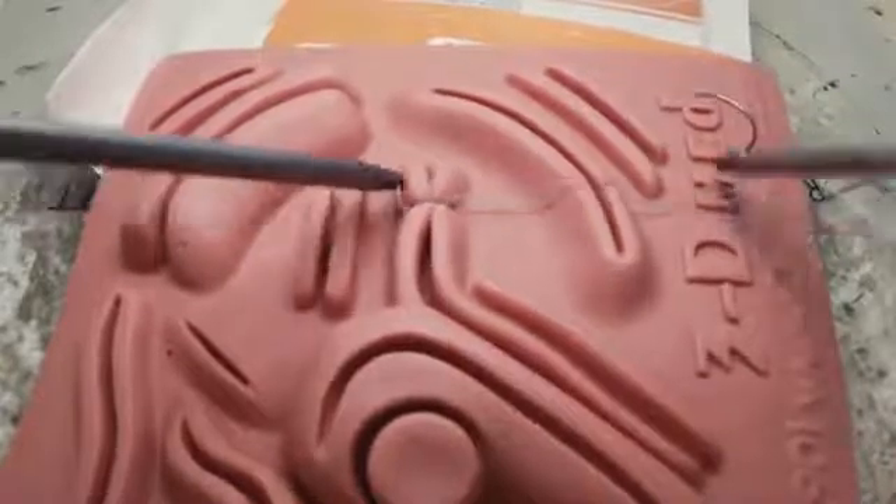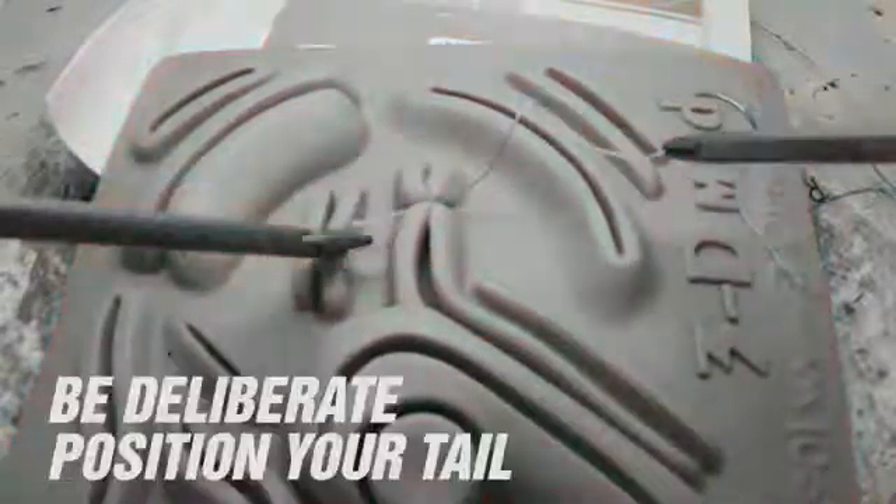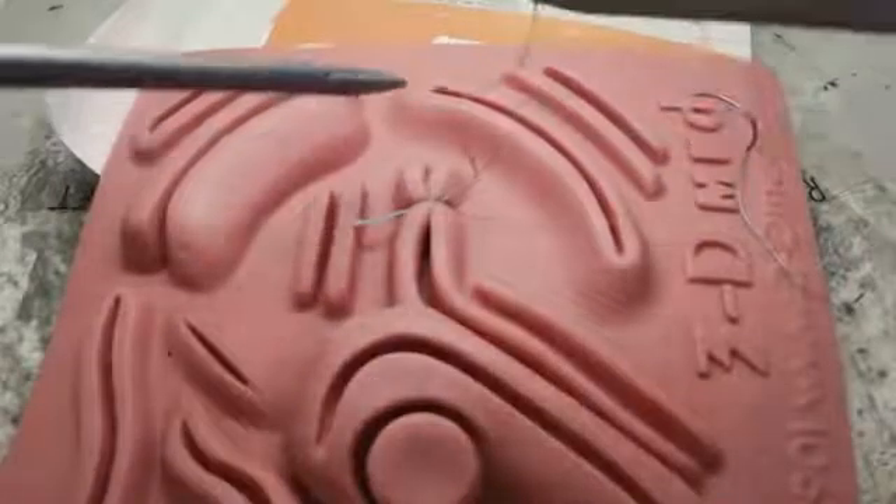Be deliberate in placing your tail where it'll be easy to find later. Because we're going below the loop to make our tie, our tying instrument will end up below our grasping instrument, and so the tail should be placed down so that our grasping instrument doesn't get in the way.